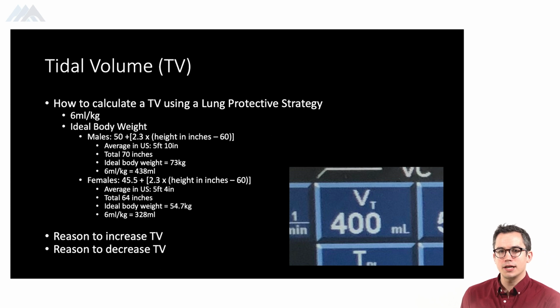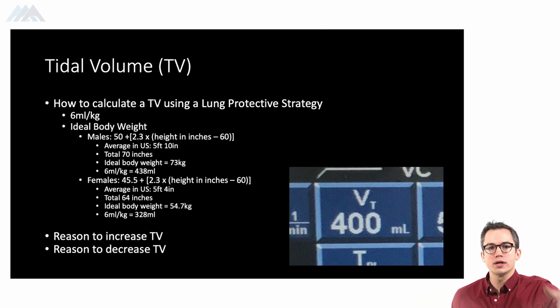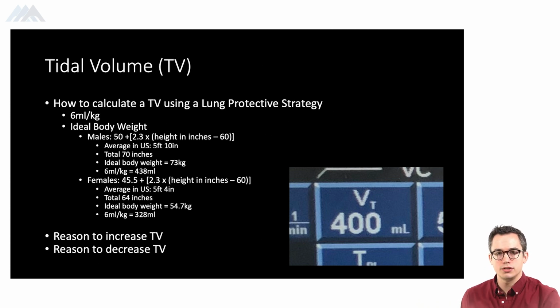Now that we have our starting point of tidal volume, we need to know what that is going to do if I increase that volume or decrease that volume. An indication for increasing that tidal volume is if our CO2 was too high. Because what do we want to do? Take a larger breath in, so we take a larger breath out. Every time that we exhale, we're exhaling more CO2. So the larger volume you inhale, the larger volume you exhale, and that is going to drop your CO2.